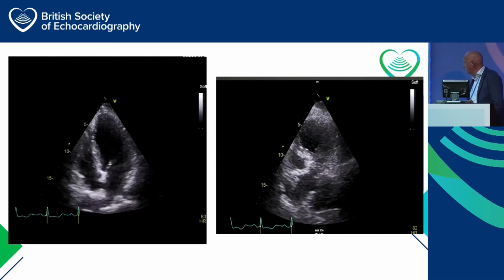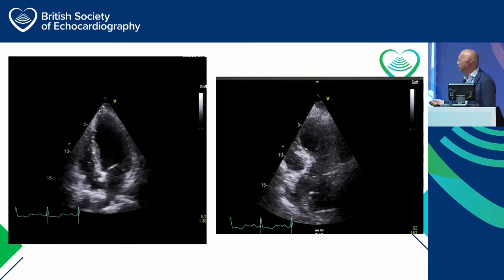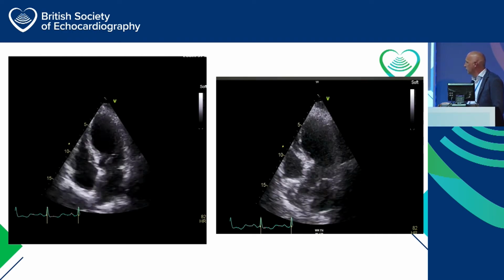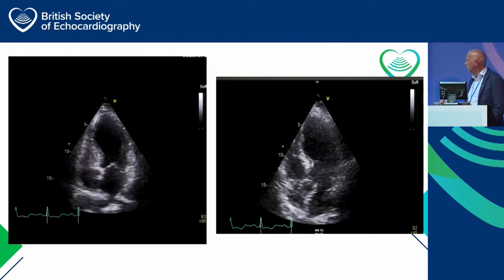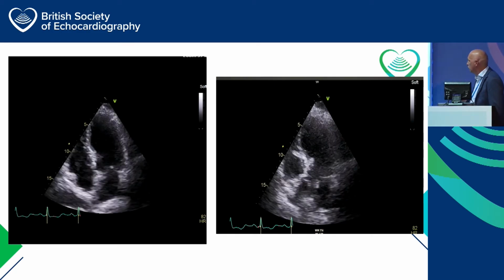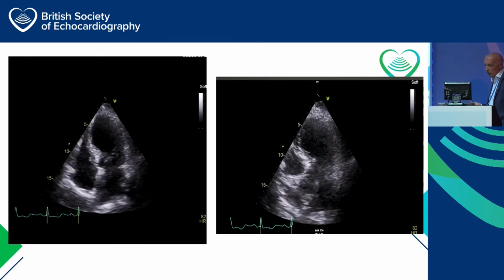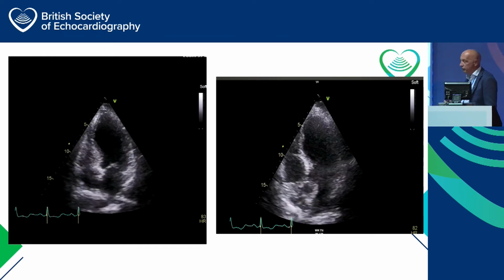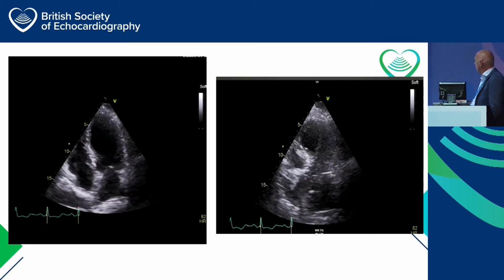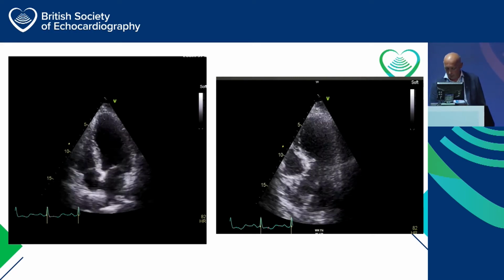So here is a 4-chamber view. As you can see that the aortic valve is not in, so we're representing the inferior septum right round to the apex down the lateral wall. And you can see basal preservation occurs here, but there's pretty much a ballooning of that apex with no motion in those areas. This is a 5-chamber view, so the anterior aortic valve is in situ, and therefore we've got some more of the anterior septum around here, and the lateral wall is in there as well.